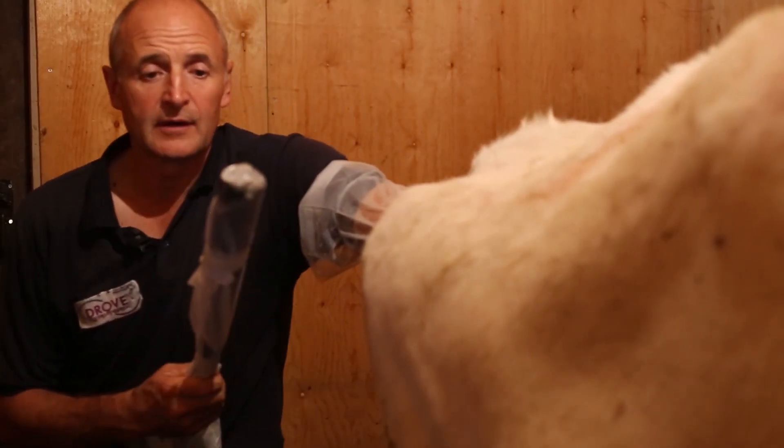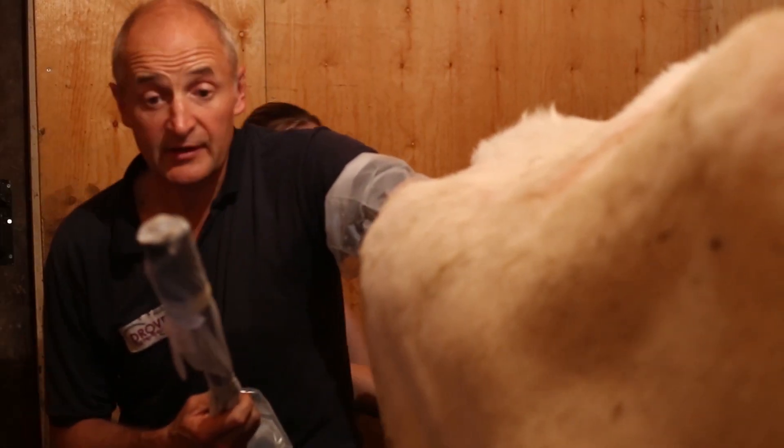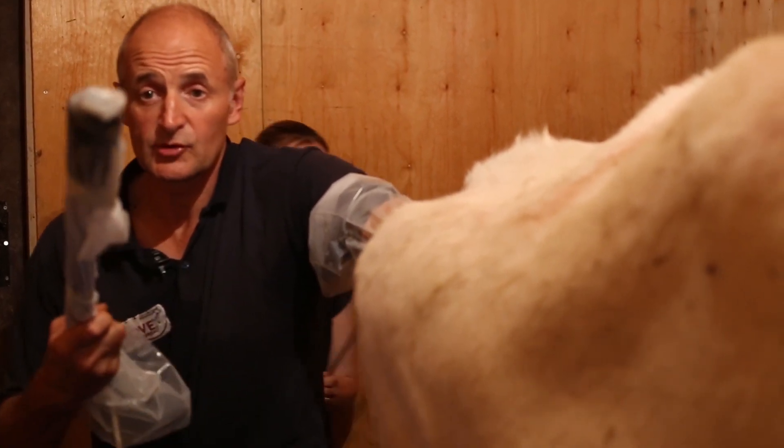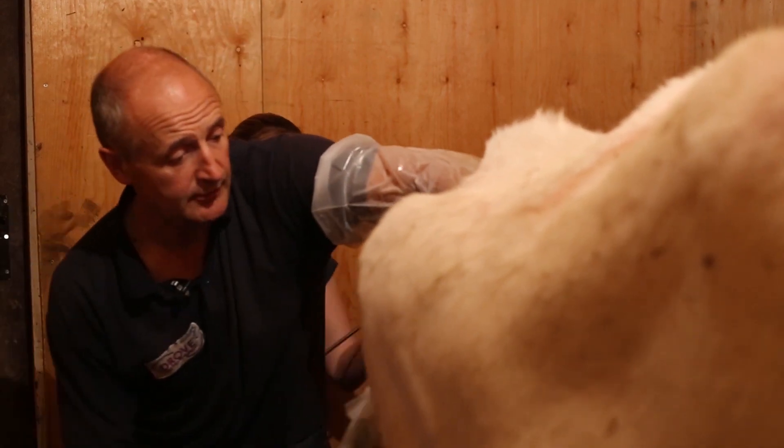I'm making sure the whole area is completely clean, just using a couple of swabs with surgical spirit to make sure everything is nice and clean before we put the probe into the vagina. Inside the glove on top of the head of the probe is a little bit of KY jelly to ensure we get a nice picture, and on the outside of the glove is some lubricant to make it easy to go inside the cow.